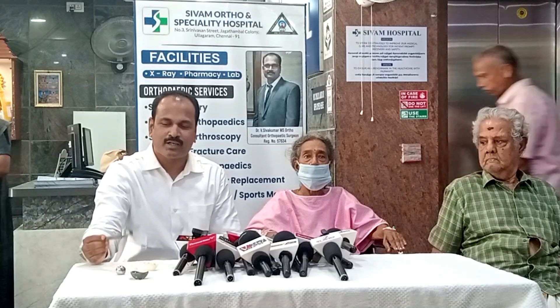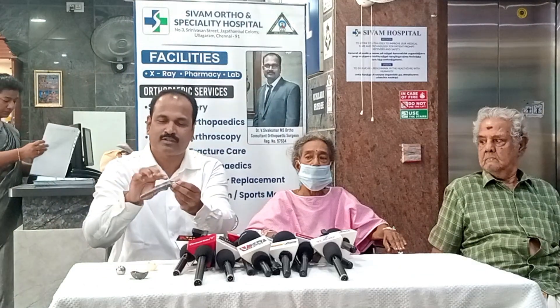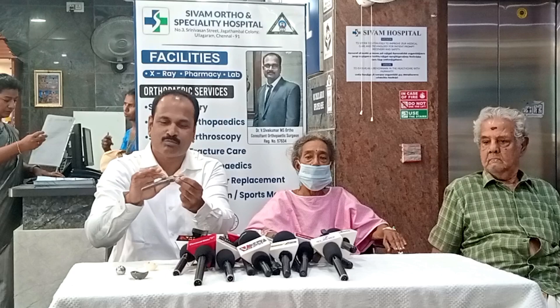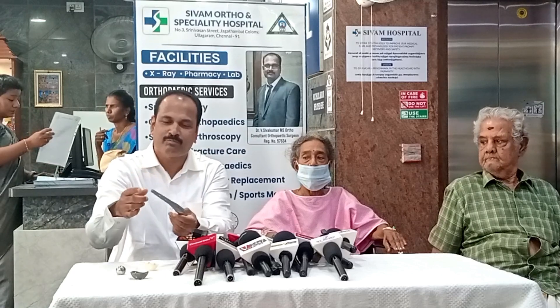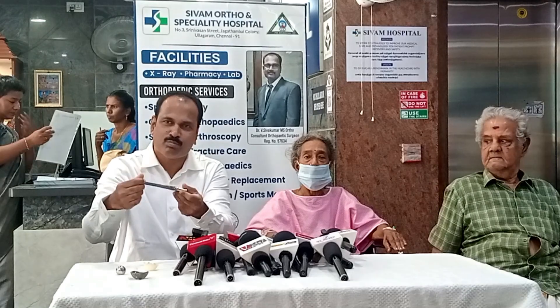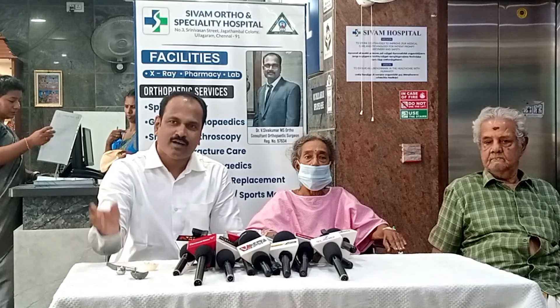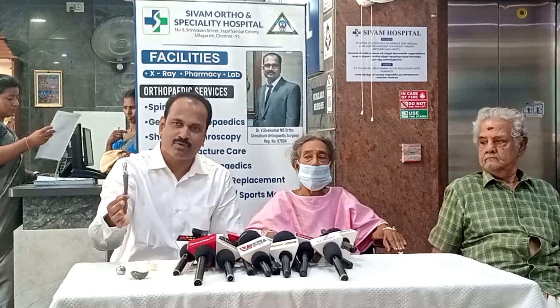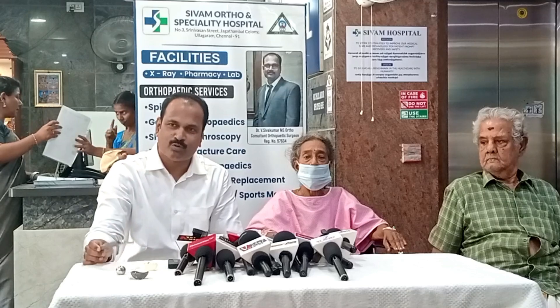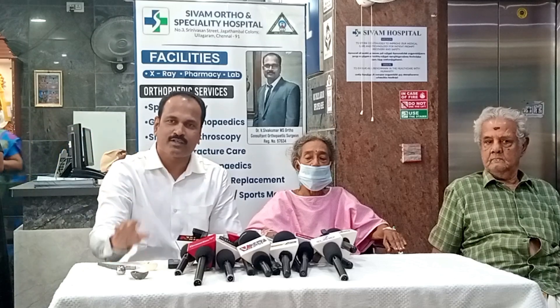The second point is removing the stem. The proximal portion has a lot of instability, but at the same time the distal portion is integrated by the bone. So this is why we remove the stem. Once we remove the stem, we use cement glue fixed to the femoral stem. On the acetabular side, we use cement and the cup. The bone defect is corrected using a bone augment.